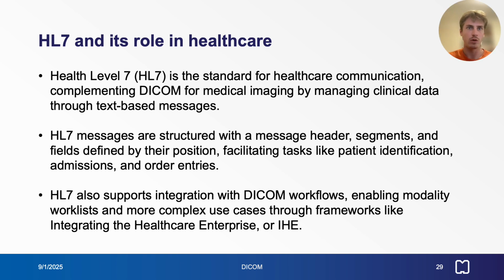Health Level 7, or HL7, is the general standard for healthcare communication, complementing DICOM for medical imaging by managing other clinical data through text-based messages. HL7 messages are structured with a message header, segments and fields defined by their position, facilitating tasks like patient identification, admissions, and order entries. HL7 also supports integration with DICOM workflows, enabling modality work lists and more complex use cases through frameworks like Integrating the Healthcare Enterprise, or IHE.